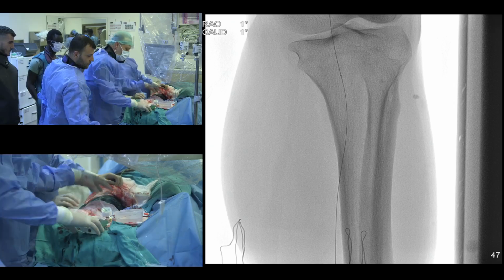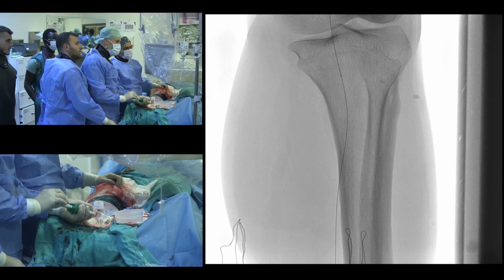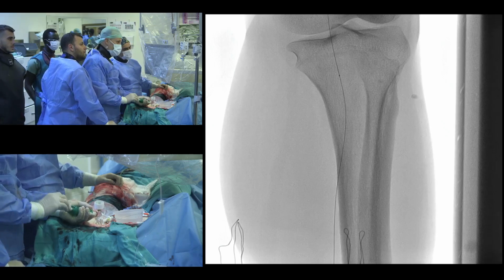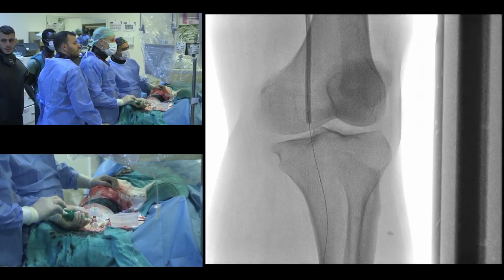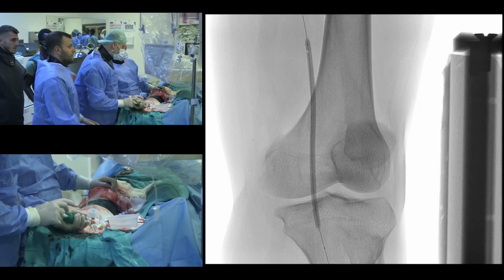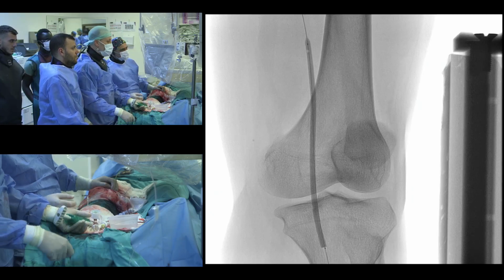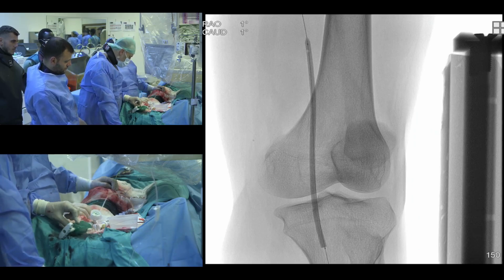After the balloon dilatation, we'll have another image. Yeah, after the balloon dilatation, and then you can. Okay. Ersan, what is the size of this balloon? It's still 5? 4 and 150.